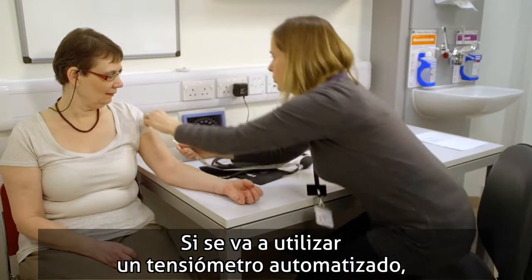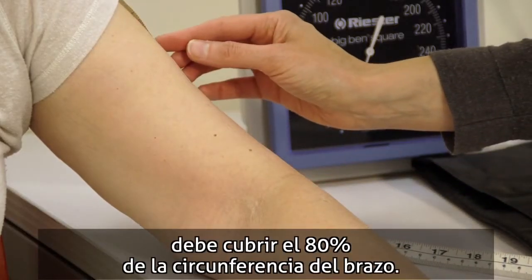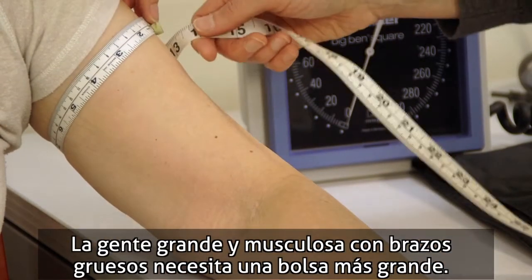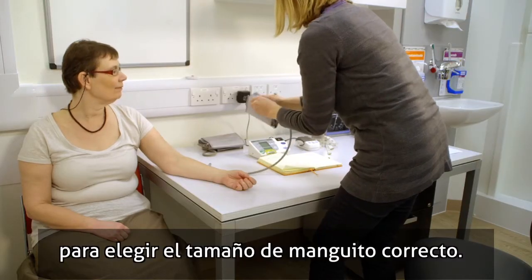If using an automated blood pressure measurement machine, the length of the bladder on the device should be 80% of the circumference of the upper arm. Larger, more muscular people with thick arms need a larger bladder. So at this point you'll need to measure the arm and use the appropriate cuff size.